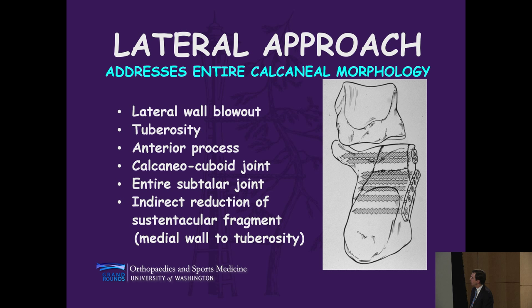And the one caveat is that there is an indirect reduction of the sustentacular component of this injury to the medial wall of the tuberosity. But that indirect reduction actually facilitates more rapid healing because you don't disturb the blood supply on the medial side.